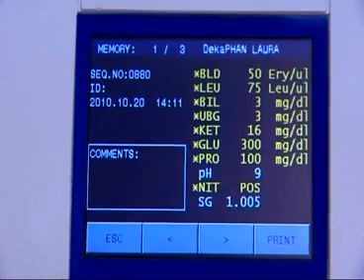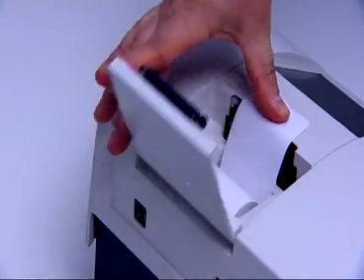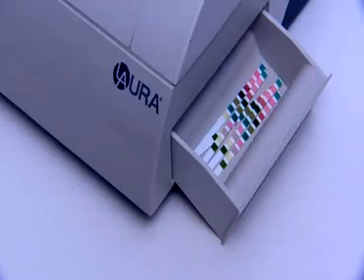The LoRa Reader comes with an inbuilt thermal printer as standard, which is very quick and quiet, and it is easy to change the paper. Another advantage is the built-in waste container for used strips.